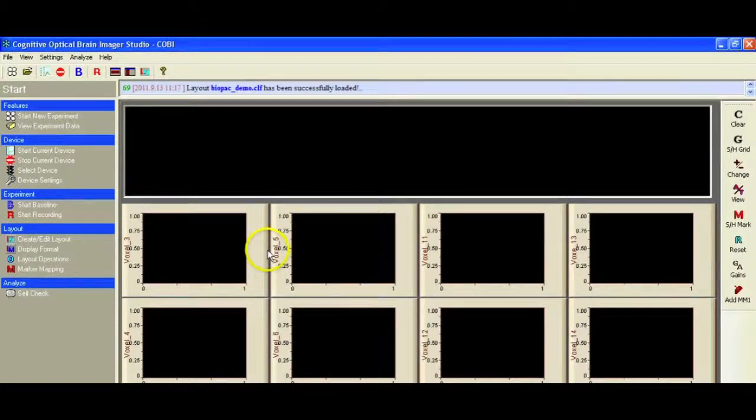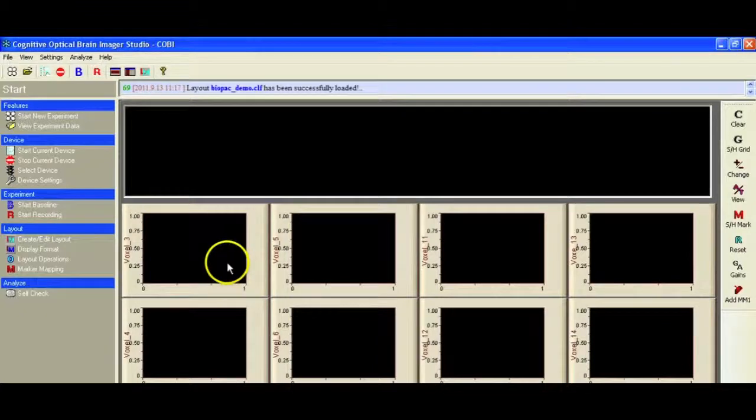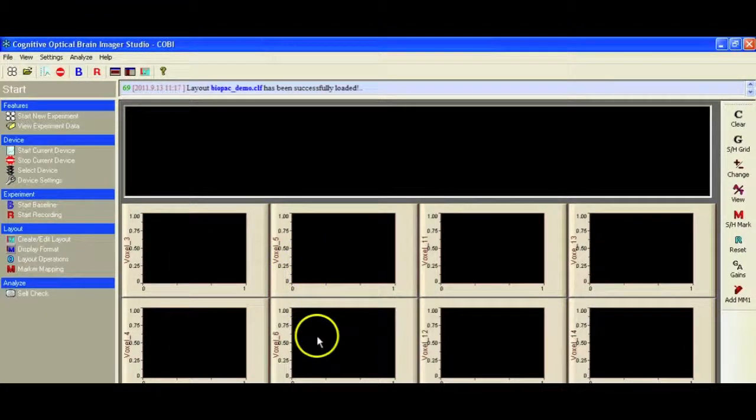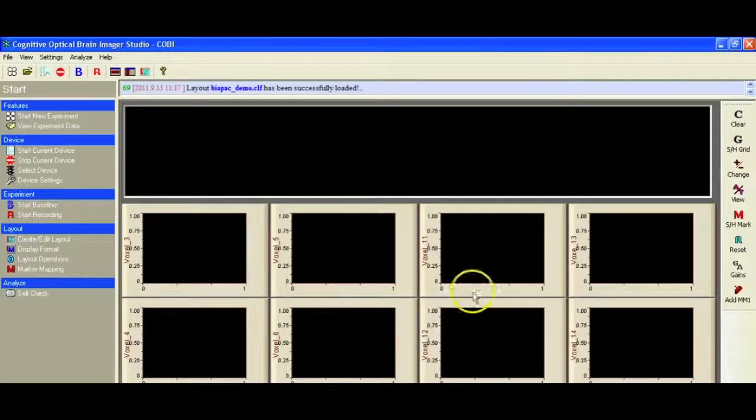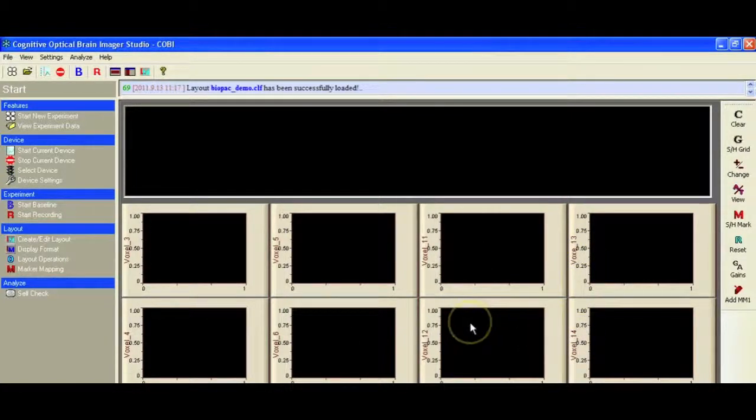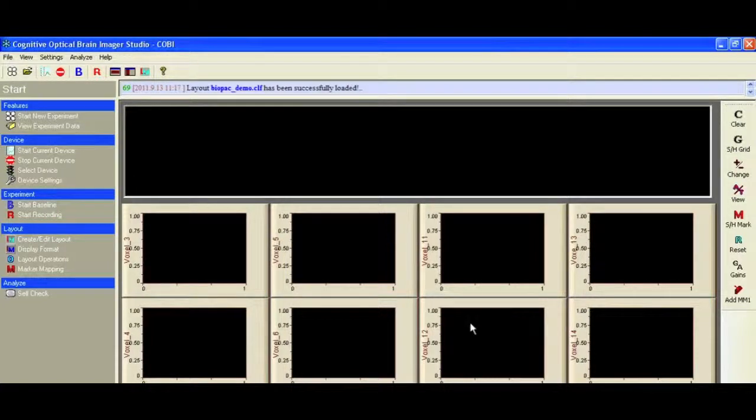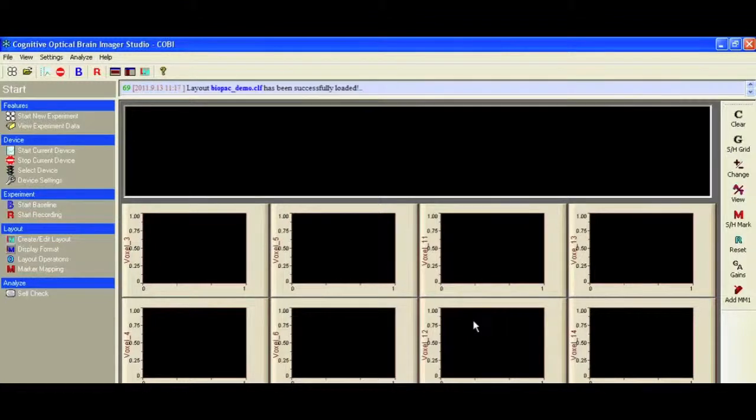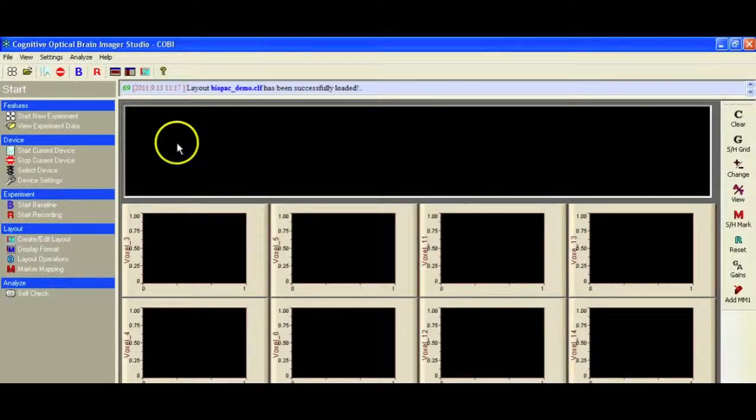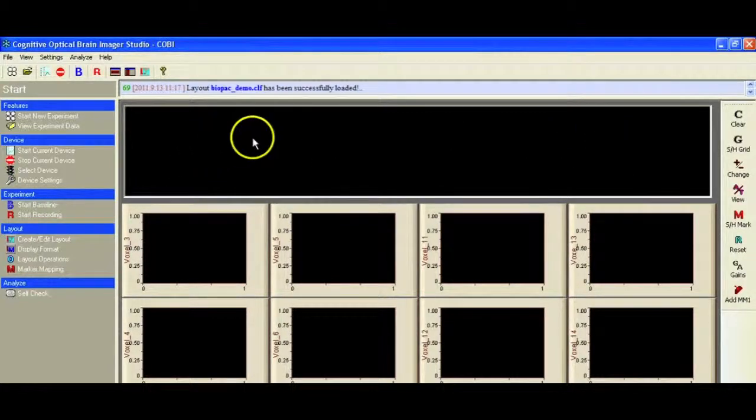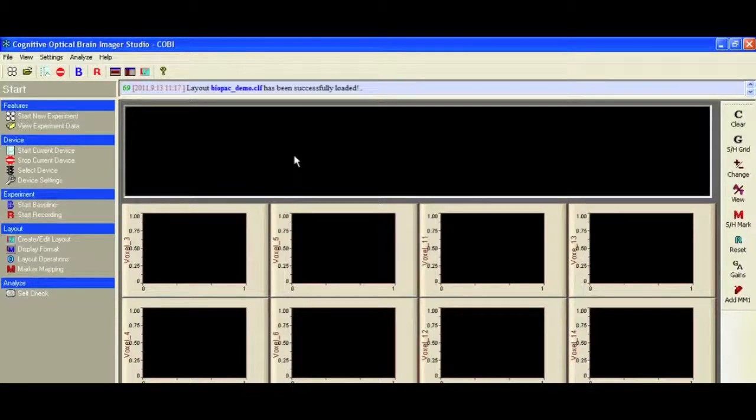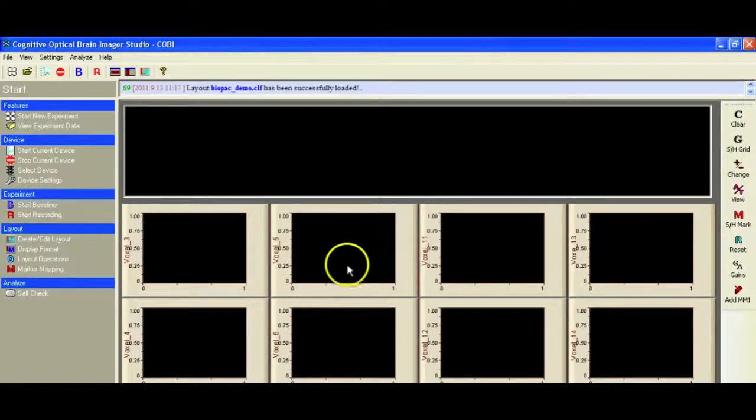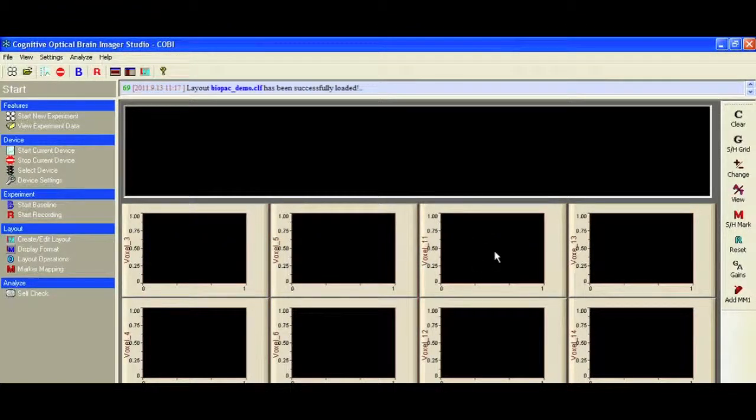In this particular setup we're looking at 8 of the voxels. This is channel 3, 4, 5 and 6 on the one side, and 11, 12, 13 and 14 on the other. So we're not looking at all 16, we're actually only looking at half of the sensors. I should also mention at the top here we've got a new display. This gives us a heat map, so you get sort of a more general indication of what activity is taking place, whereas these individual graphs down below give you a channel by channel indication.